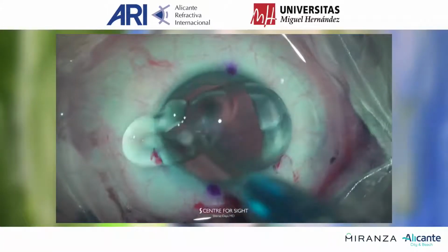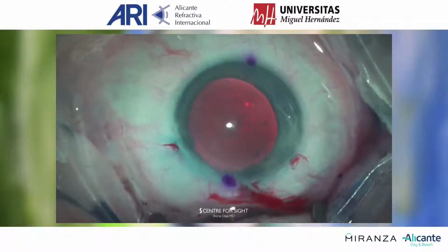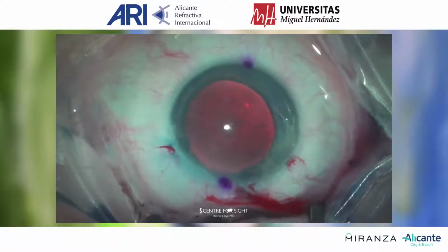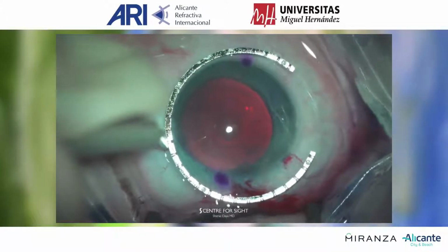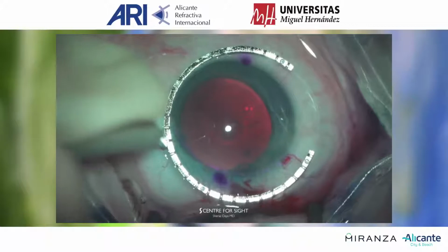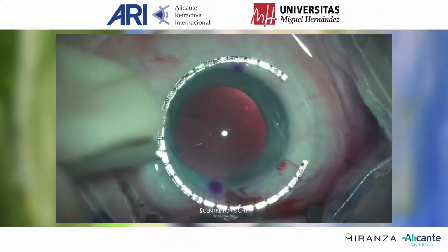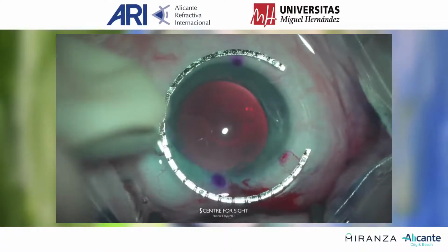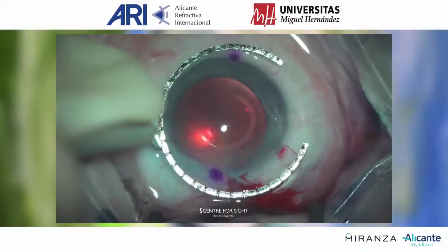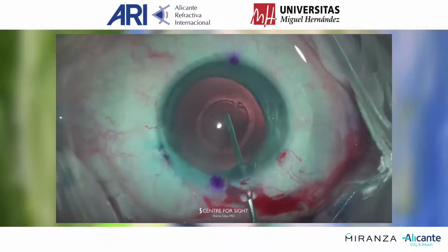This is the Capsulaser, the methylcellulose being placed on the cornea, and a fixation ring. You can see the red circle for the Capsulaser, and the focusing is now being refined before the foot pedal is depressed. And here is 0.3 seconds, and we've got ourselves a nice capsulotomy.